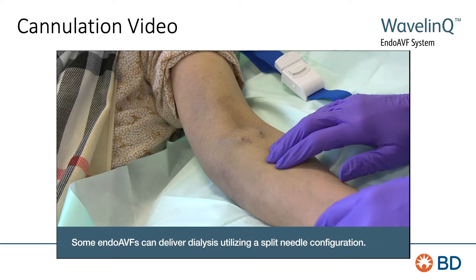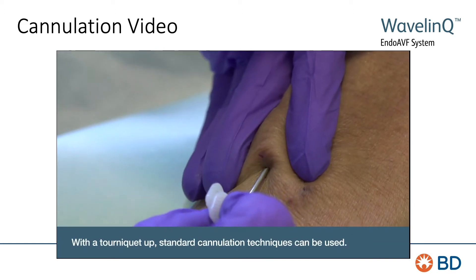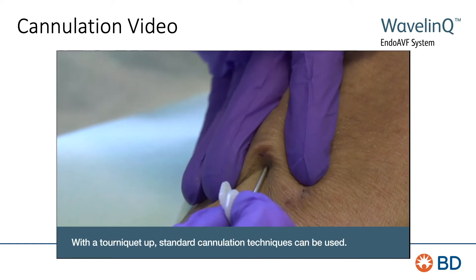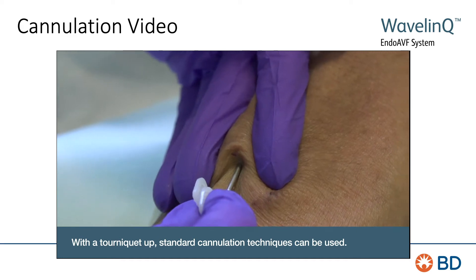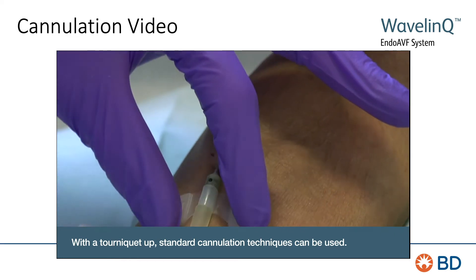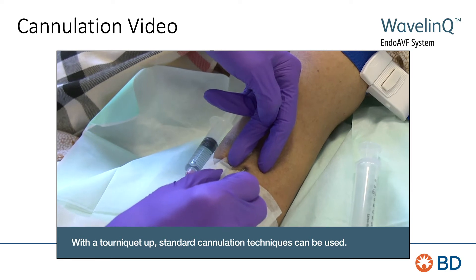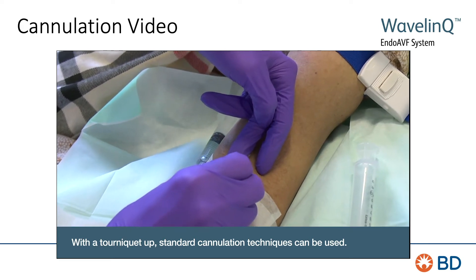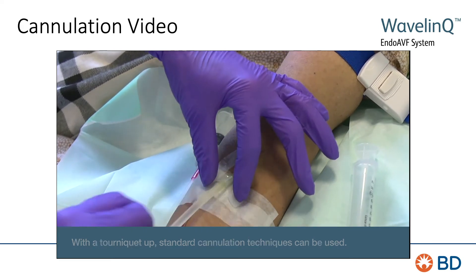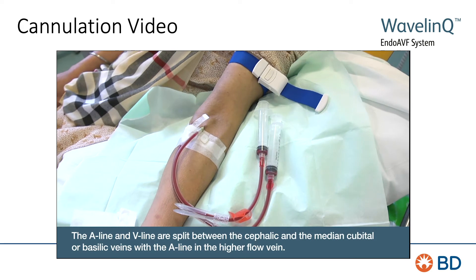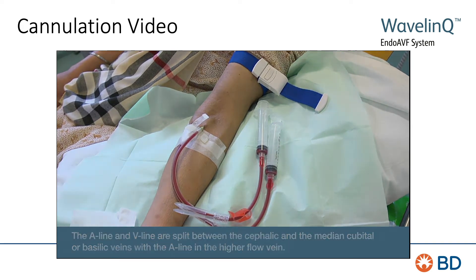Some endovascular fistulas have a split flow and may have needles placed in different vessels. That is demonstrated here. Again, with the tourniquet up, standard cannulation techniques can be used. Here you see the arterial and venous lines are split between the cephalic and median cubital vessels. The arterial line is placed in the vein with the higher blood flow.